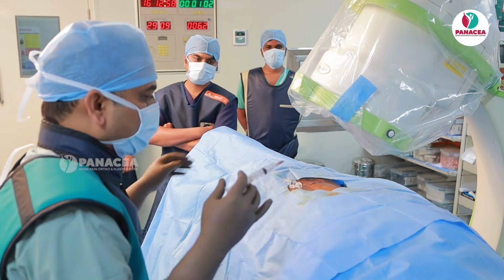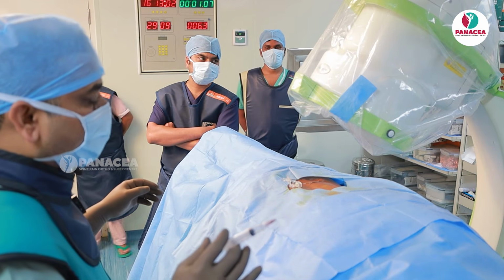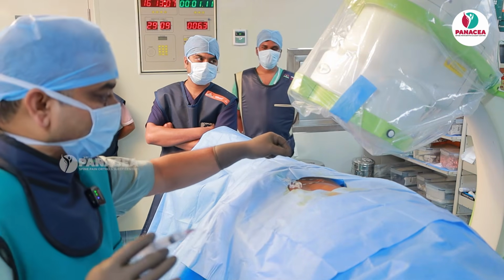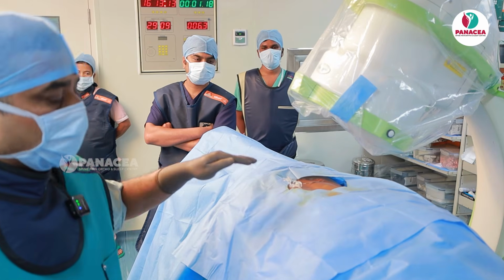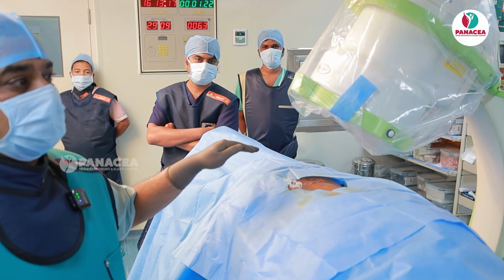There are no shortcuts in the procedure, because sometimes a Kambin's approach can land inadvertently inside the disc. So a small skin tag, if it is pushed inside the disc, can cause discitis. So you are supposed to do proper scrubbing before doing the procedure. It is no less than a surgery. So there is no confusion.